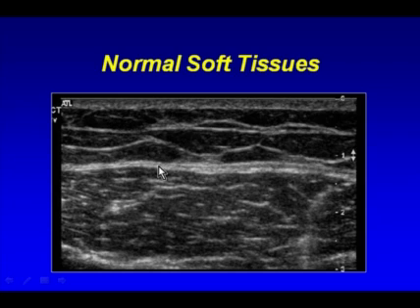Often then there will be a bright fascial plane that separates the subcutaneous fat from the underlying muscle, and the muscle is seen here with its characteristic pennate pattern, that one sees in muscles with little bright fibroadipose septa that are separating hypoechoic muscle bundles.